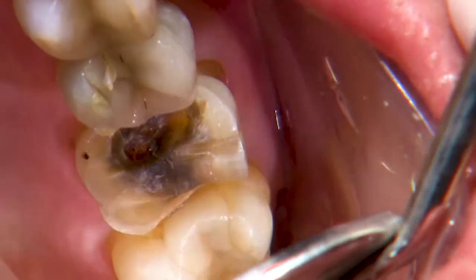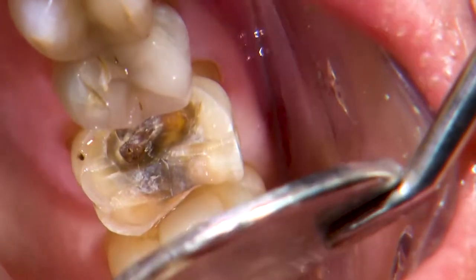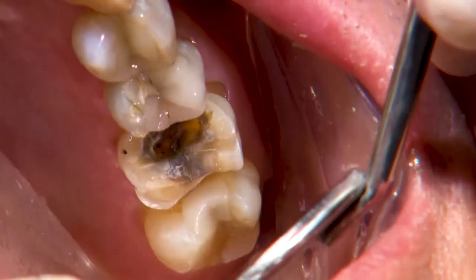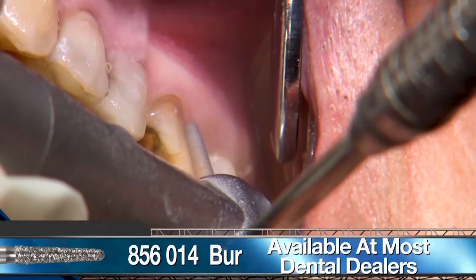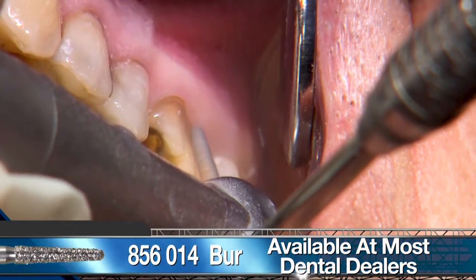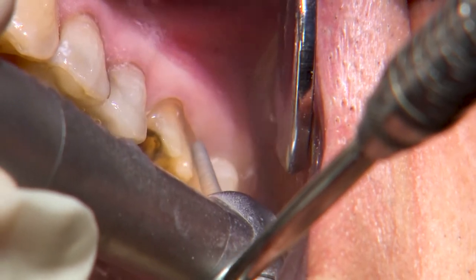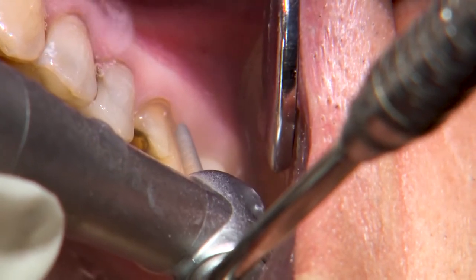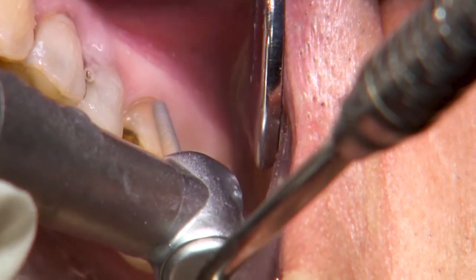By air drying the tooth, you can also get a better visualization of any remaining cement, which I prefer removing to have a fresh tooth surface to cement to. I'm using a coarse grit 856-014 round ended tapered diamond bur to reduce the buccal to a depth that blends in with the abfraction and also to connect to the finish line of the original prep.